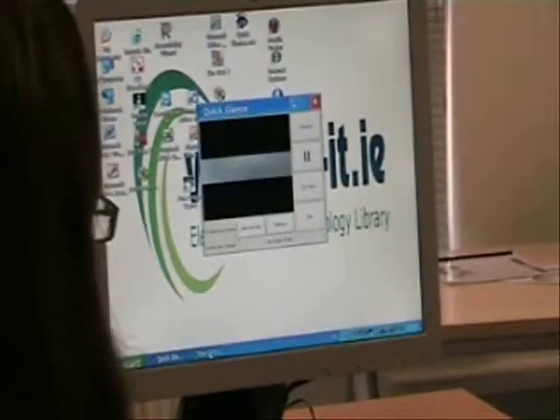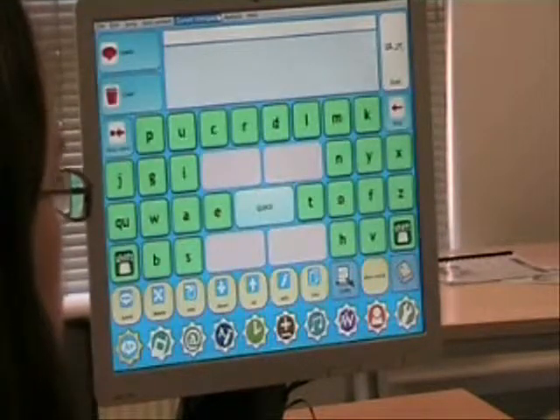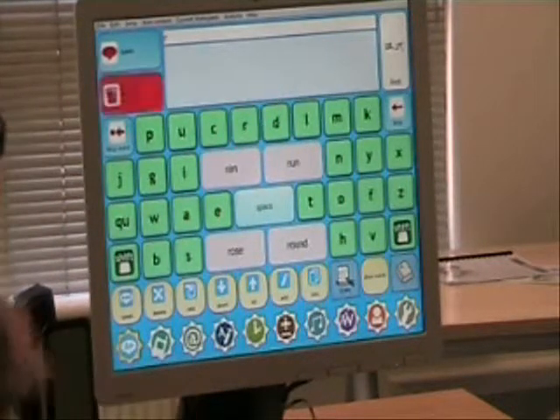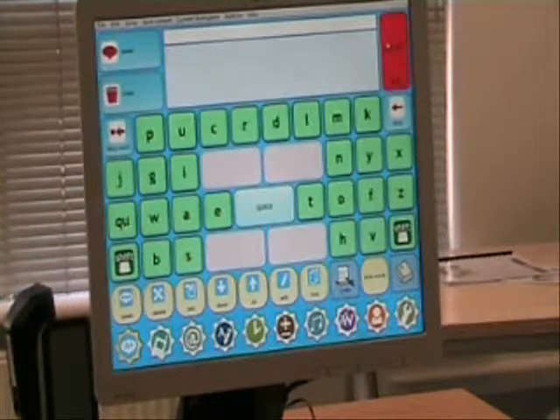What I'm going to do now is open up the software called Grid 2. This software allows you to control the computer, as I said earlier. We have it arranged by frequency of use for people who use eye gaze, so the letters you use more often are in the centre of the screen.